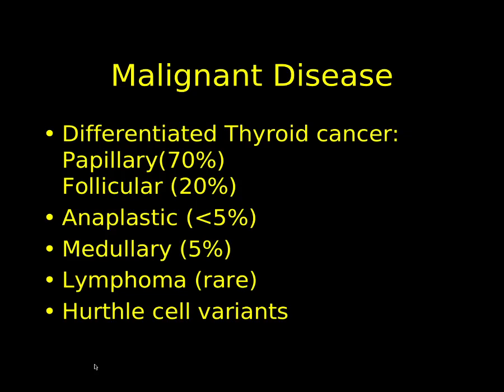Medullary carcinoma of the thyroid, well, this isn't really part of the thyroid gland at all. In effect, it's a separate organ which just happens to reside in the same location. And for that reason, we don't use radioactive iodine to evaluate and look for metastatic disease in medullary carcinomas. We have a completely different set of tracers which we can use to examine those.